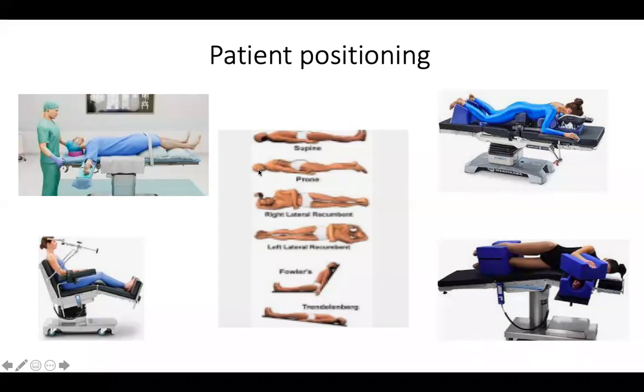In that case, if a patient is supine and they're not doing bowel surgery or anything of that nature where there's a risk of aspiration, you can, by all means, put in an LMA. So patient positioning is very important because it relates to the airway, hemodynamics, pressure points, and nerve injuries, and also to how your lines are going to sit and how you're going to access the patient. So you need to prepare for this.